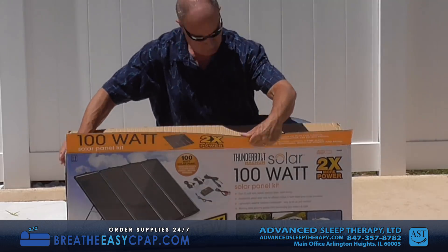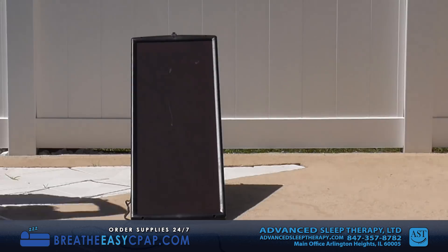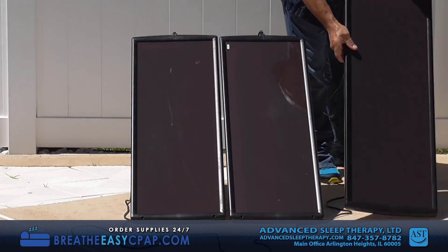This is a 100-watt solar panel kit consisting of four 25-watt panels. For flexibility, they are amorphous silicone solar panels, so direct aiming at the sun is not necessary.